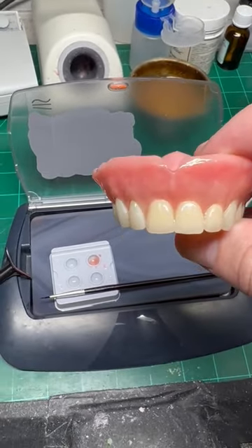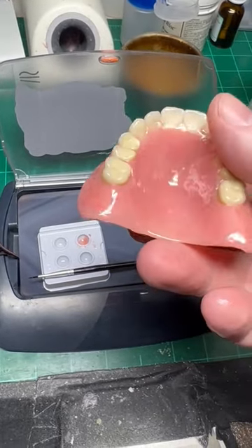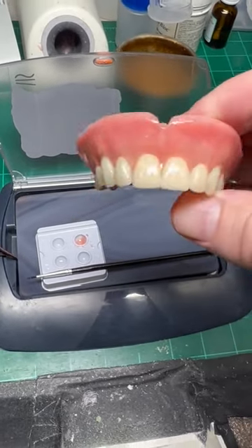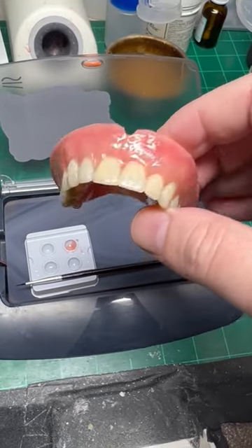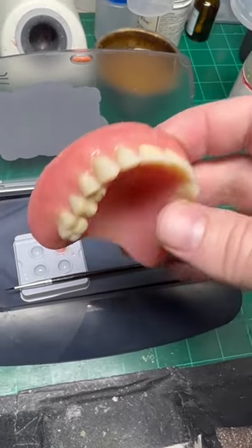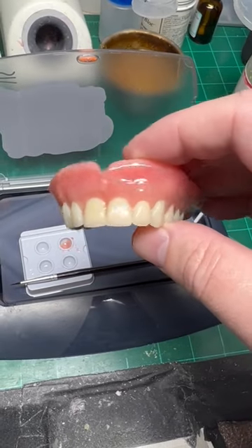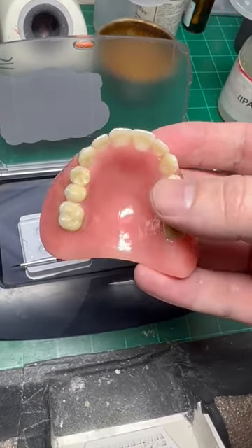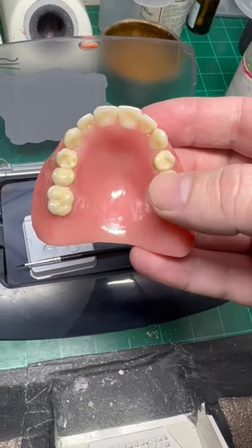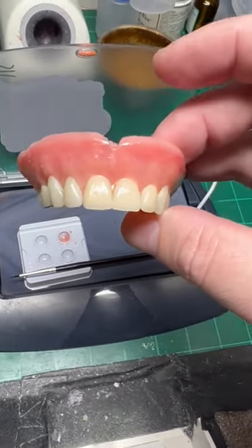At this point we have the repair done. The case has been re-glazed, all the micro cracks in the composite have been repaired, and the case is ready to go back. At this point I think my next recommendation is probably to get a new denture since this one is about six years old — it's probably time for a new one.